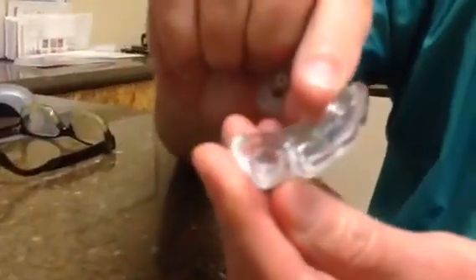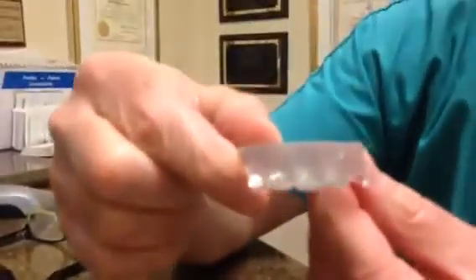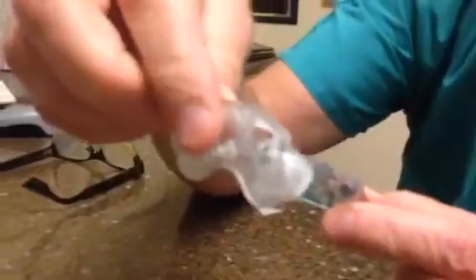So you can take a look at that. Those are his front teeth. And this is where we're going to be placing the implant, where this missing tooth is. And this is also created with a 3D printer.